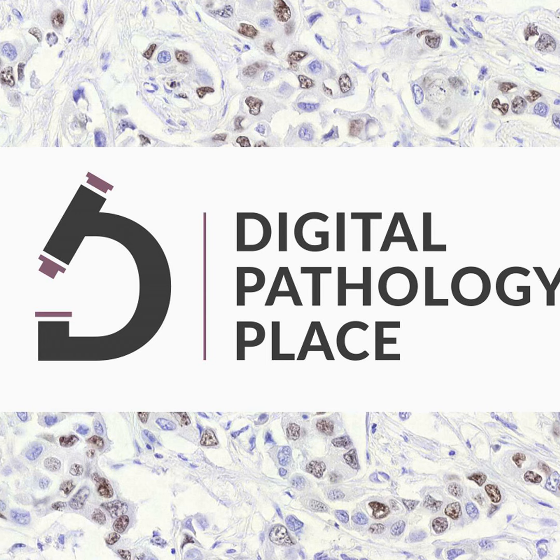6. Documentation of digital pathology use in pathology report. The FDA emphasizes the importance of documentation within the pathology report, inclusive of a peer review statement if whole slide images replace glass slides. This level of transparency guarantees that every process step is traceable and verifiable.